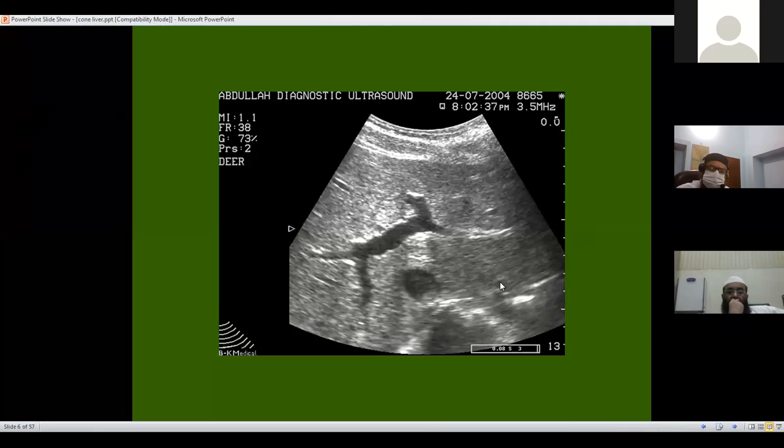Liver on ultrasound is always convenient because it is lying right adjacent to the chest wall and, in the epigastrium, right adjacent to the probe, to the anterior abdominal wall. In the epigastrium, we can place the probe directly upon the liver, while the right lobe, which is behind the rib cage, we can always see through the intercostal spaces.